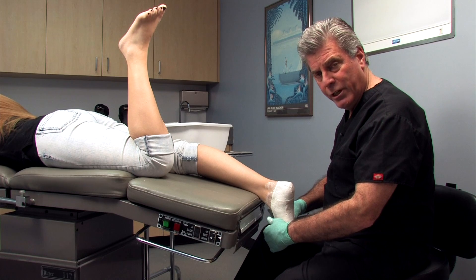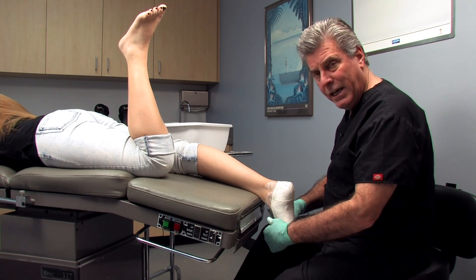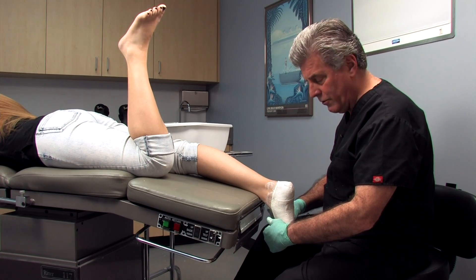That correction is not necessary when we do a supine cast — that would be an advantage of the supine technique, as it doesn't require you to push against any of the metatarsals.